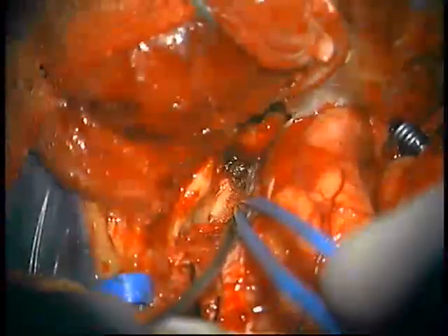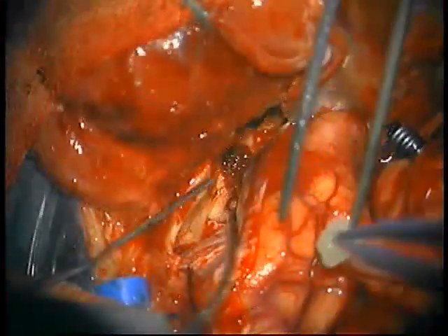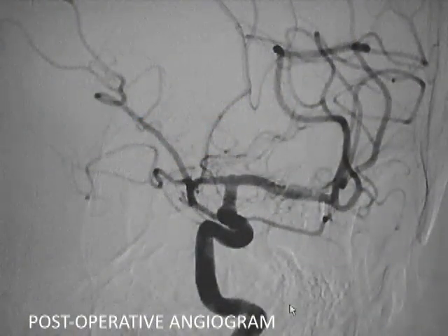The surgical putty used to have proximal vascular control is taken out, and we put in place a small piece of surgical sponge. The post-operative angiogram shows a total obliteration of the aneurysm.